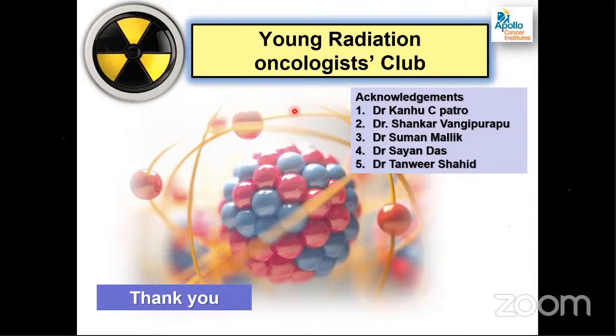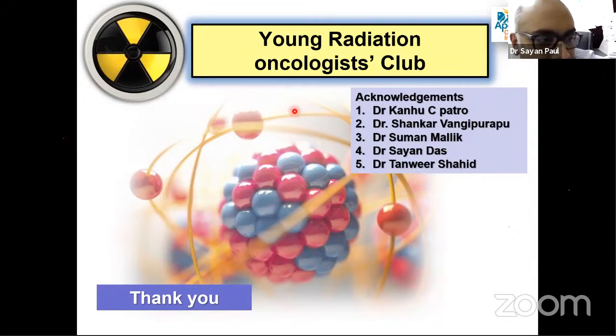Next is what is the usefulness of post-treatment imaging? I didn't get the question. Post-treatment imaging of what? Probably what he is saying is that there are many articles published. They wanted to check the intrafraction error. So what they do is they take an image before the treatment and they take an image after completion of treatment, and then you can calculate how much the patient has moved during the treatment, how much the isocenter has moved. That you can determine with that.